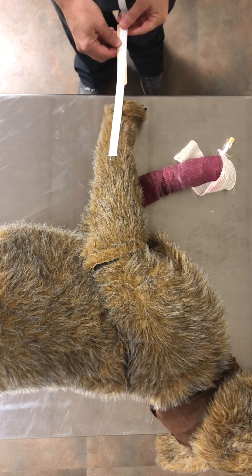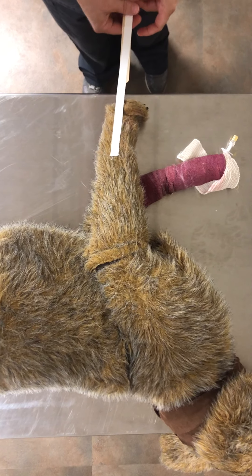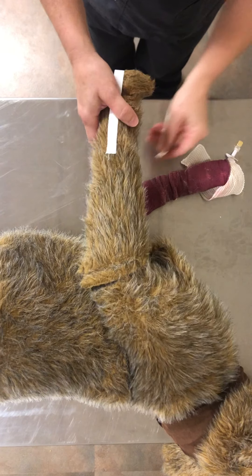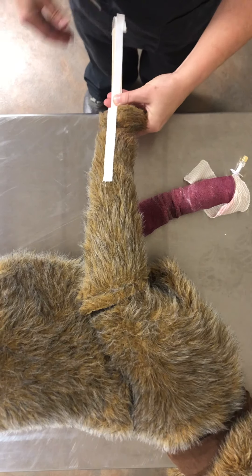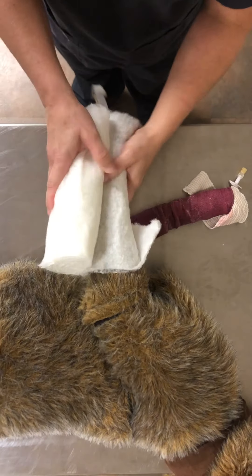Robert Jones bandage for radius ulnar fracture. Place stirrups medial and lateral unless wounds are present — do not place stirrups in wounds. Use a tongue depressor to make life easier for yourself. Do not stick tape to the patient's pads.